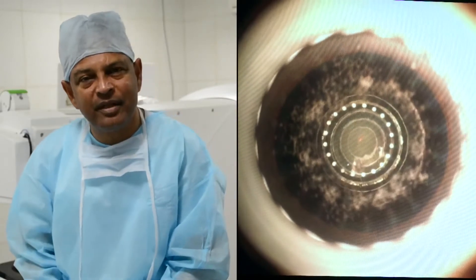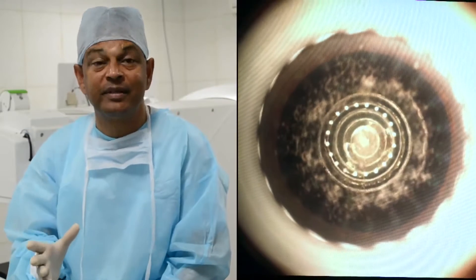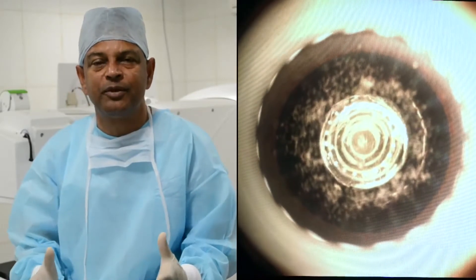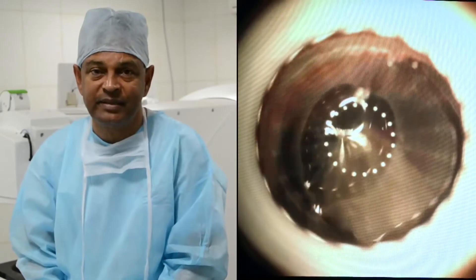Then I tried, along with the cross, also circles. The circles were tried with the idea that I would get some amount of liquefaction. That helped me with my FACO settings.